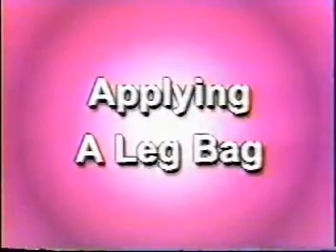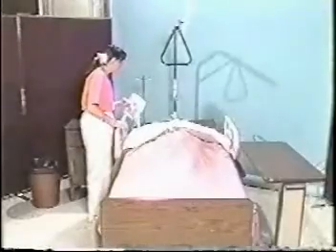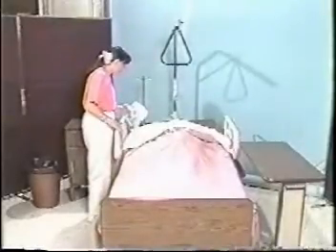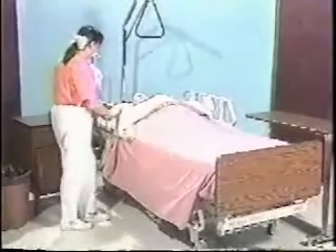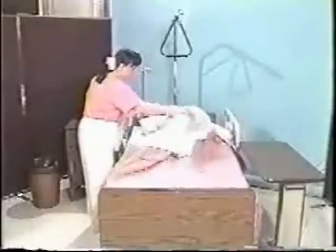Applying urinary drainage leg bag. Wash your hands and apply your gloves. Assemble needed equipment. Explain the procedure to the patient and provide for privacy. Raise the bed to a comfortable working height. Fold back the bed linens, maintaining privacy.